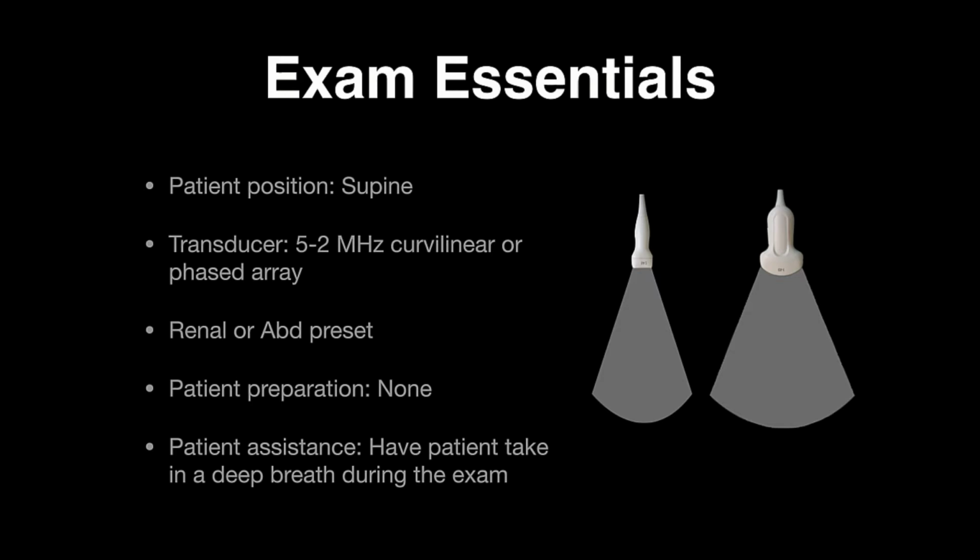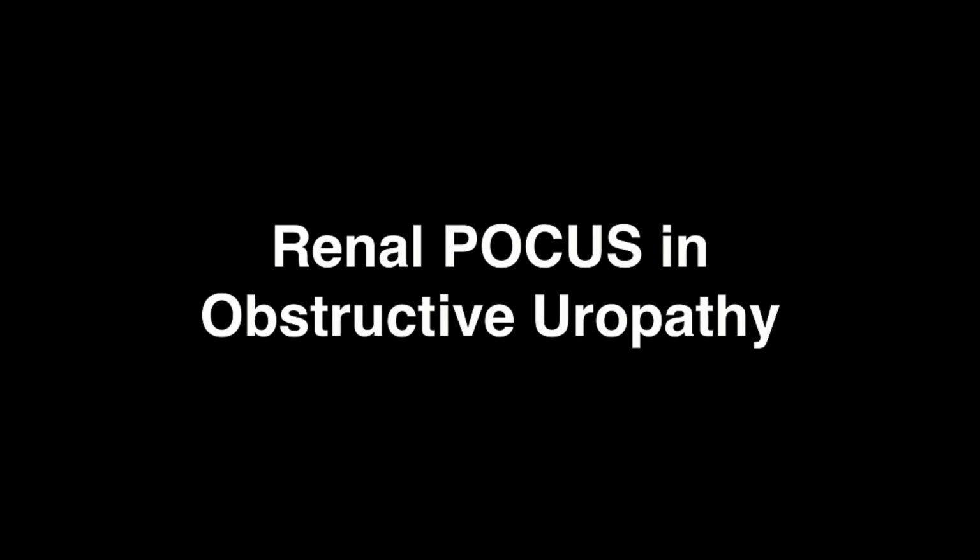You don't have to do any patient prep. You don't have to wait for them to be NPO for 8 hours. And sometimes you can obtain better windows by having the patient take in a deep breath, because it pushes things in a caudal direction. So that may be something to try during the exam.